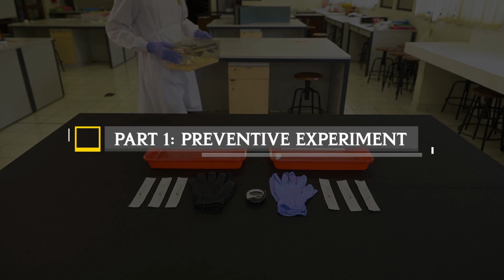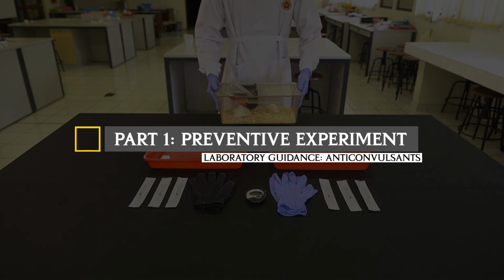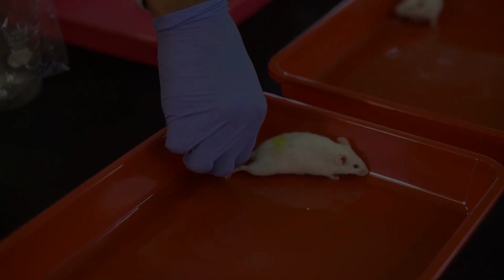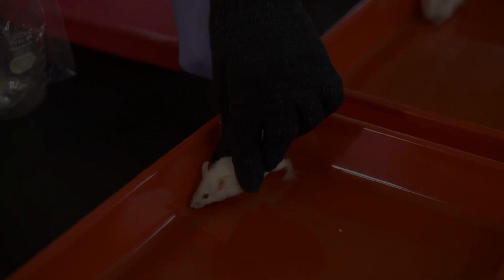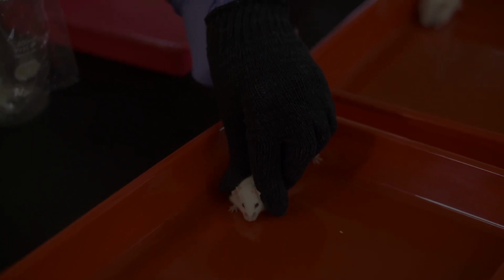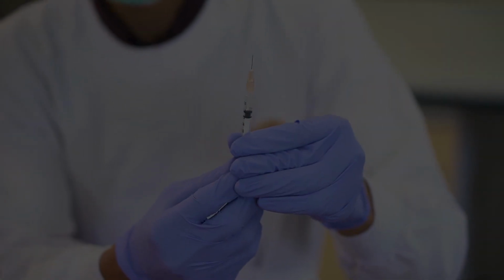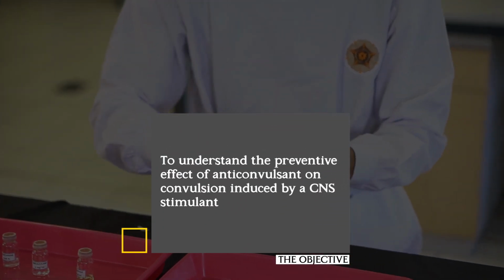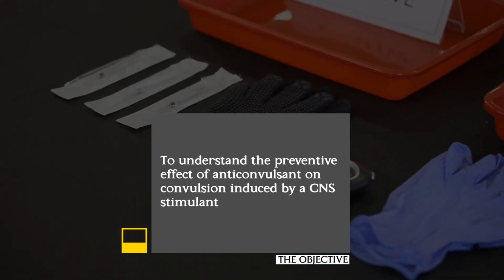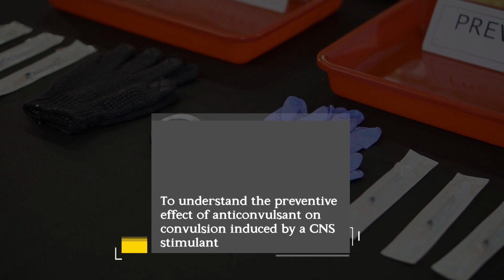In video part 1, we will learn how to calculate the dose for mice and how to conduct the preventive experiment. In video part 2, we will learn how to conduct the curative experiment. By conducting the experiment in video part 1, we will understand the preventive effect of anticonvulsant on convulsion induced by a central nervous system stimulant.